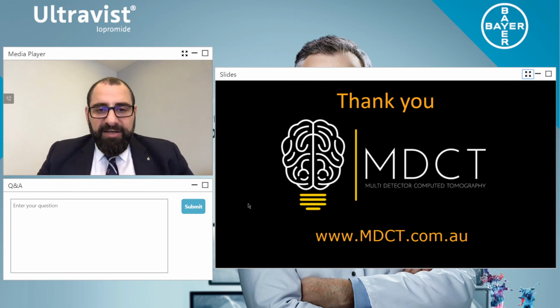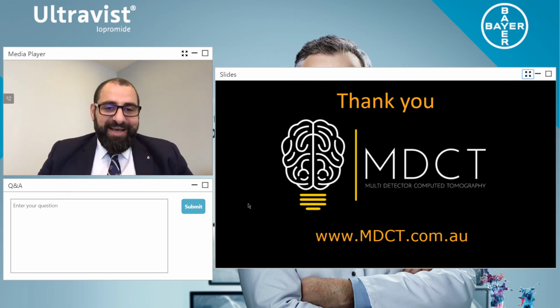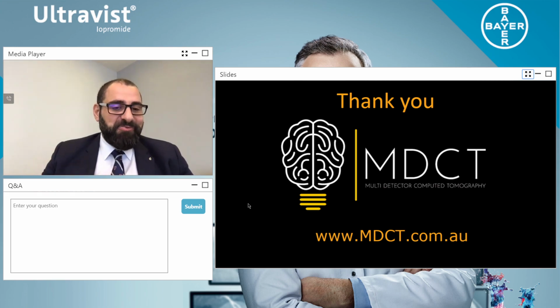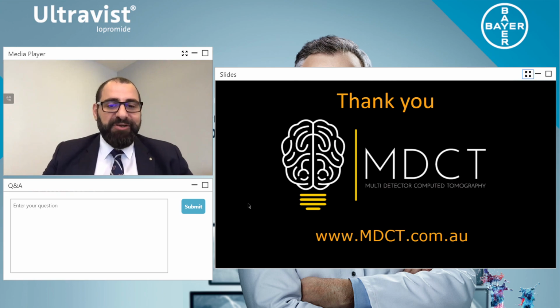Tudiongang, now, I have a great question. I noticed that you use different delayed times to assess washout phase in different hepatic masses. What are the factors that determine the delay time that you use? Fantastic question. Tudiang, let me be very clear. I always like to use 8-minute delay time. And this gives me good consistency for all my lesions. Once we get accustomed to that, that's perfect. The last thing you want, more importantly, is every person doing something different. And this is where Bayer have found this issue. Everyone is doing something different. So we want to streamline, we want consistent imaging, we want consistent techniques and protocols.